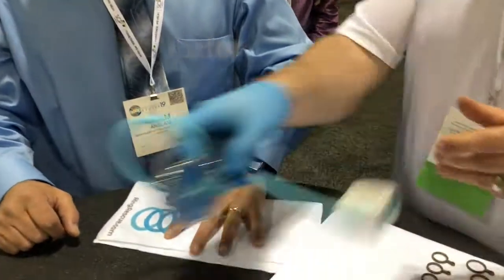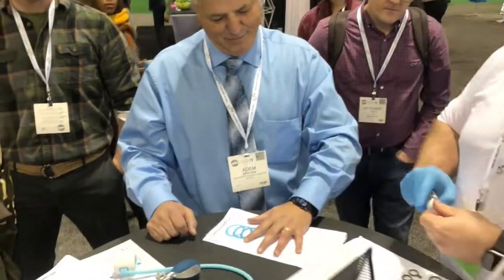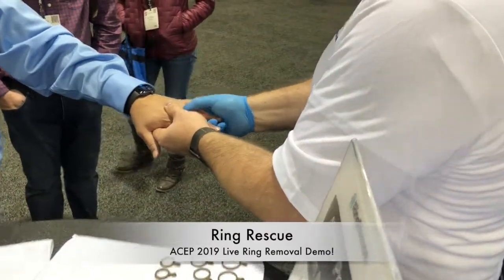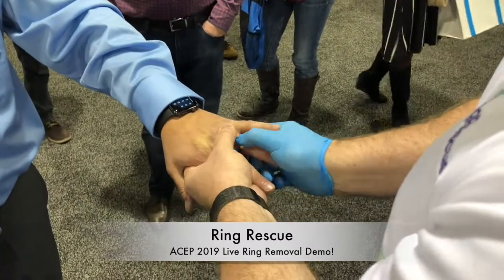You can notice your finger is noticeably smaller. And then we apply the lubricant to the ring. I'm just going to take your hand and work the lubricant underneath the ring — your ring was stuck, but see how freely it moves now? So I'm slowly going to walk it down the finger.